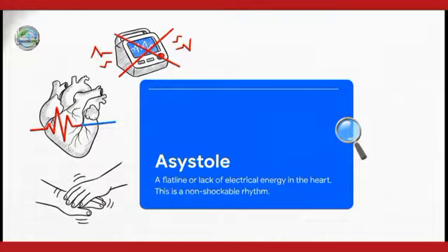You also really need to understand the term asystole. Basically, that's the technical word for a flat line, meaning there is a total lack of electrical energy in the heart. Understanding this shows exactly why you can't just rely on a machine. Asystole is a completely non-shockable rhythm. The AED will detect no energy and simply refuse to shock. That is why continuous, deep CPR is so absolutely critical. You have to mechanically pump the blood yourself because a machine cannot fix a total lack of energy.